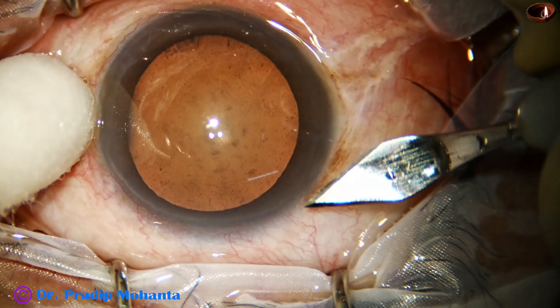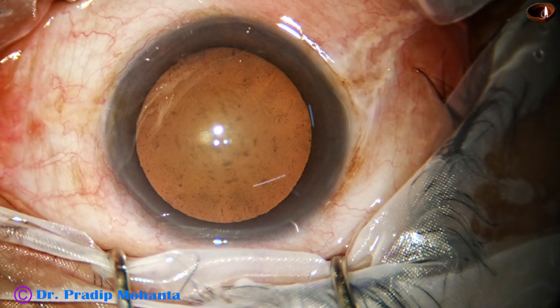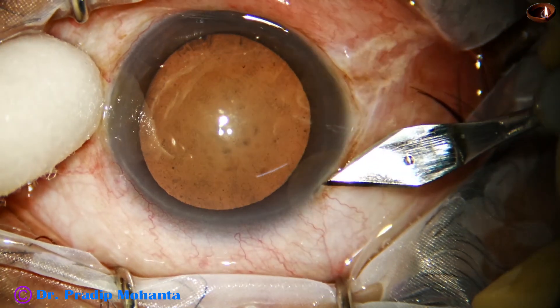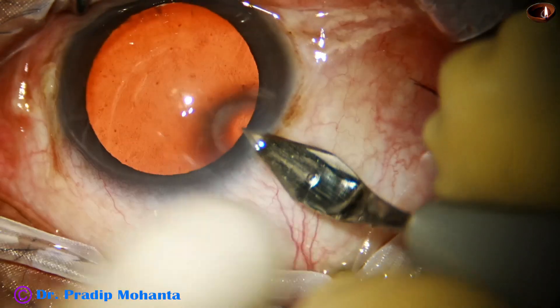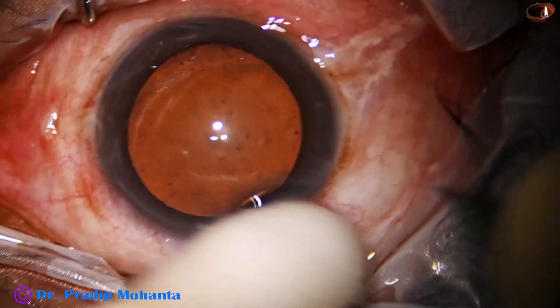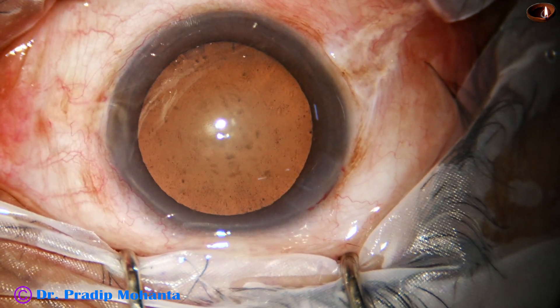The main incision is made at around 11 o'clock, or any other place you choose. This is a 2.8 millimeter steel keratome — you can use 2.2 as well.